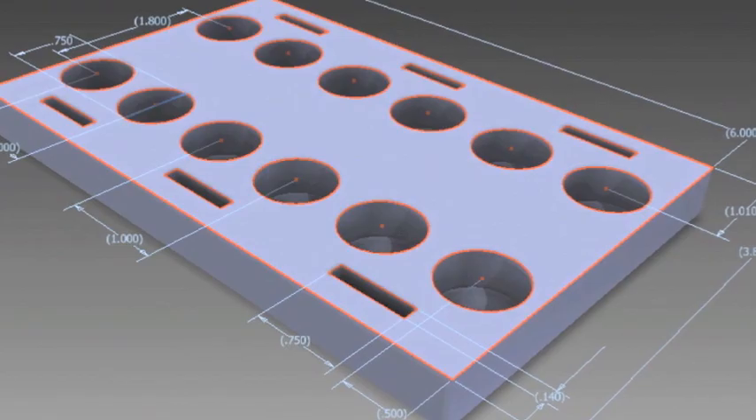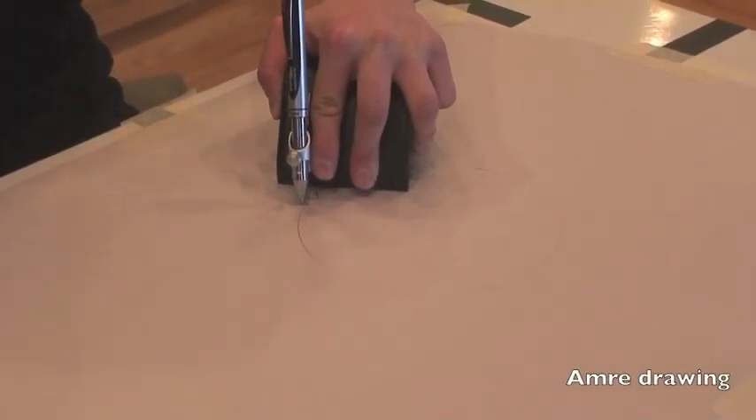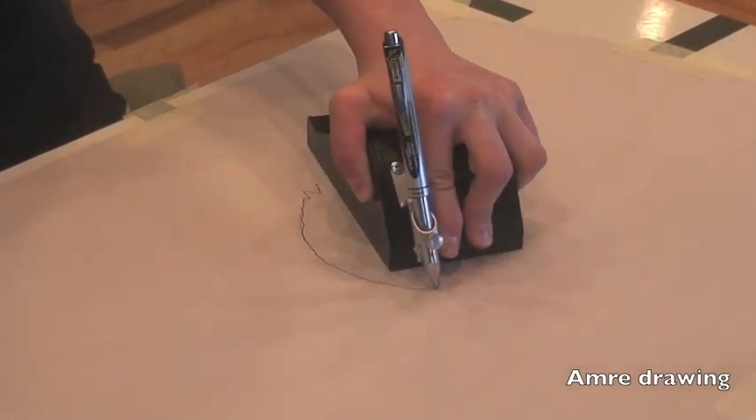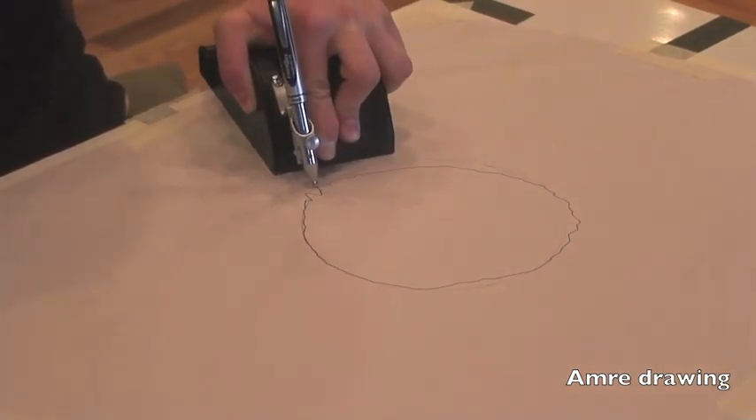This magnetic base runs over an aluminum sheet, creating magnetic braking that lessens the effect of her tremor on her drawing. The magnetic base can also be combined with a sheet of steel to prevent tremors from acting vertically and to increase resistance by adding friction.